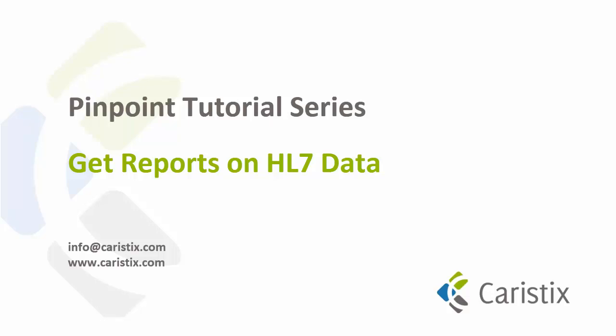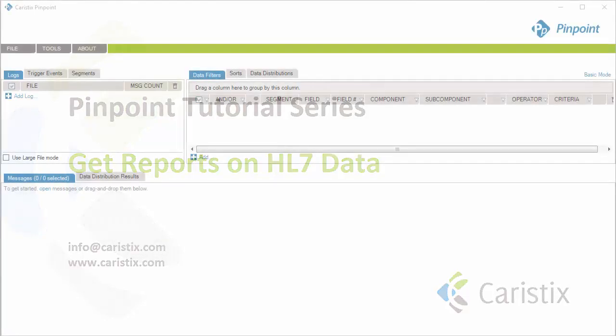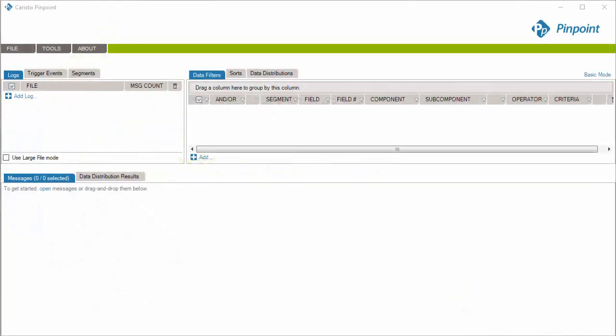Welcome to the Get Report on HL7 Data How-To Video for Caristix Pinpoint. Say you want to dig into those HL7 messages. For instance, which trigger events are exchanged between systems? What versions of HL7 are used for those messages? These questions are easy to answer with Pinpoint.